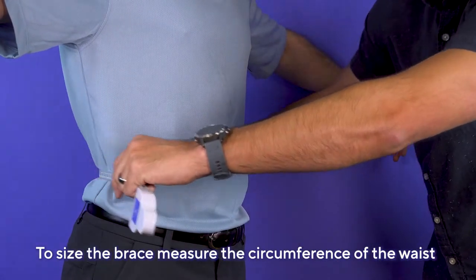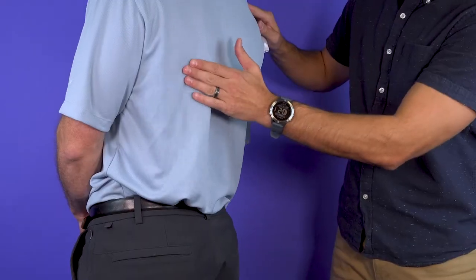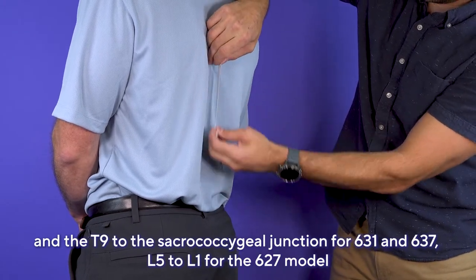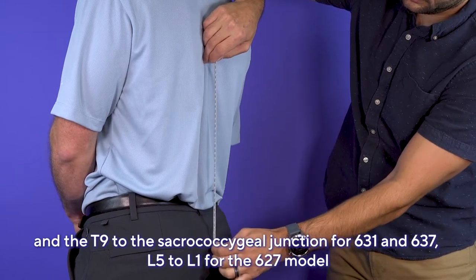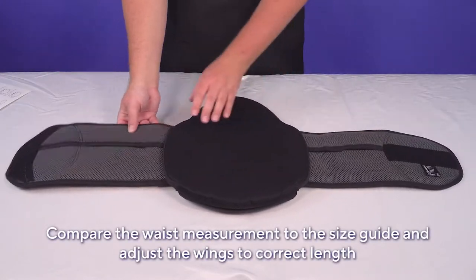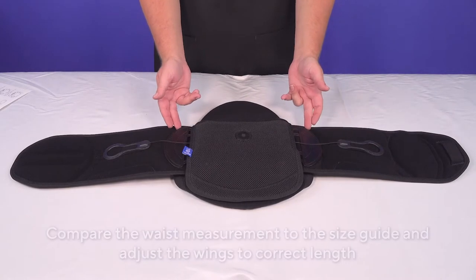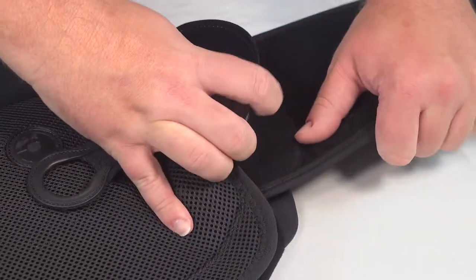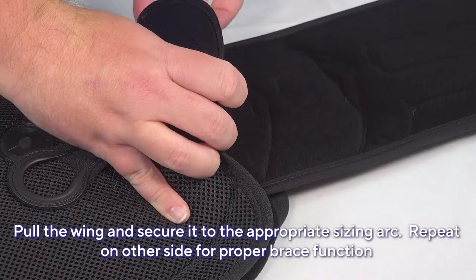To size the brace, measure the circumference of the waist and the length between T9 and the sacrocoxygeal junction for the 631 and 637 models, or L5 to L1 for the 627. Compare the waist measurement to the size guide and adjust the wings to the correct length. Detach the pull tab from the wing, place it on the back of the panel, open the crescent connector, pull the wing, and secure it using the appropriate sizing arc.